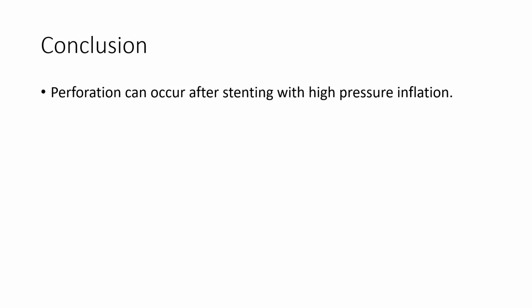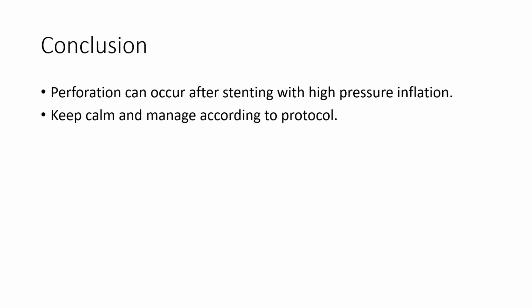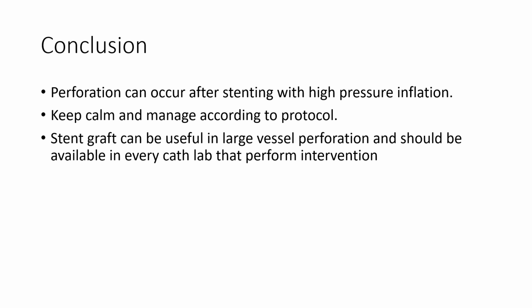In conclusion, perforation can occur after stenting with higher pressure inflation. Keep calm and manage according to the protocol. Stent graft can be useful in large vessel perforation and should be available in every cath lab that performs intervention.